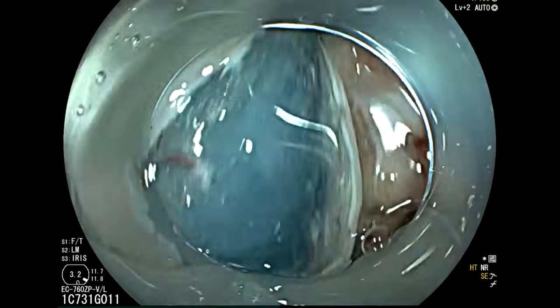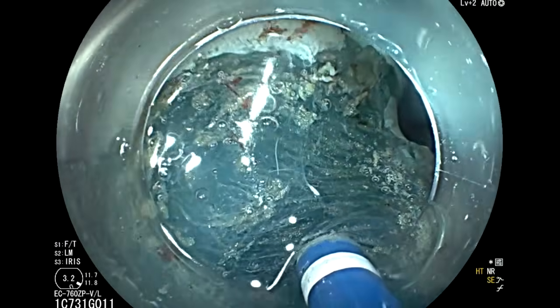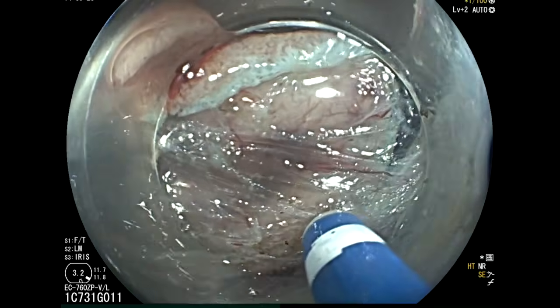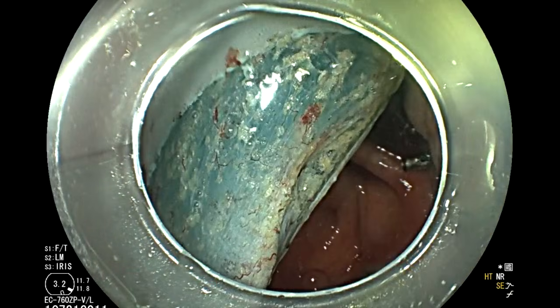With further dissection, the lesion is being pulled by the traction towards the oral side, exposing even further the submucosa, allowing for continued submucosal dissection very safely. The traction remained very effective up until the end of dissection, and mucosal defect was without any deep mural injury.